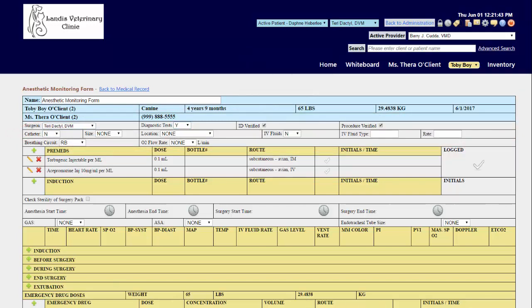Now we see under pre-meds the items that we added on the configuration side are already pre-populated for you. If you didn't use a particular drug for this patient's surgery, you can click the red X to remove it from the form.